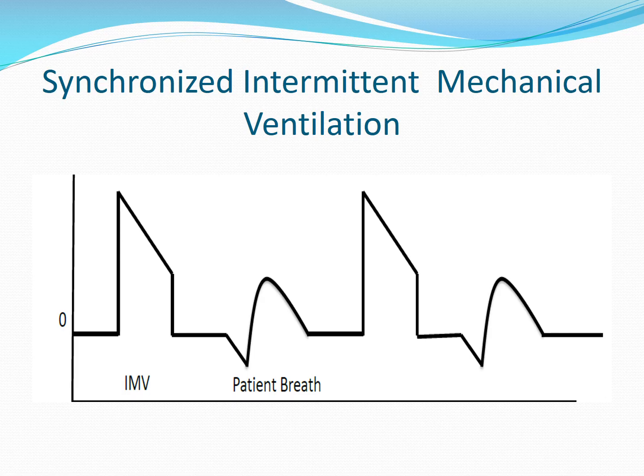So what that means is the patient's own breath is just getting that pressure support on inhalation to try to increase that tidal volume. So this person can still take spontaneous breaths. So let's say the ventilator rate was set at 8 and the total rate was 16. Well, that means that the patient took 8 spontaneous breaths on their own. So this is just showing you that the patient breaths are just supported by pressure support, and we've got to work those muscles and get them stronger so that the patient can get that higher tidal volume.